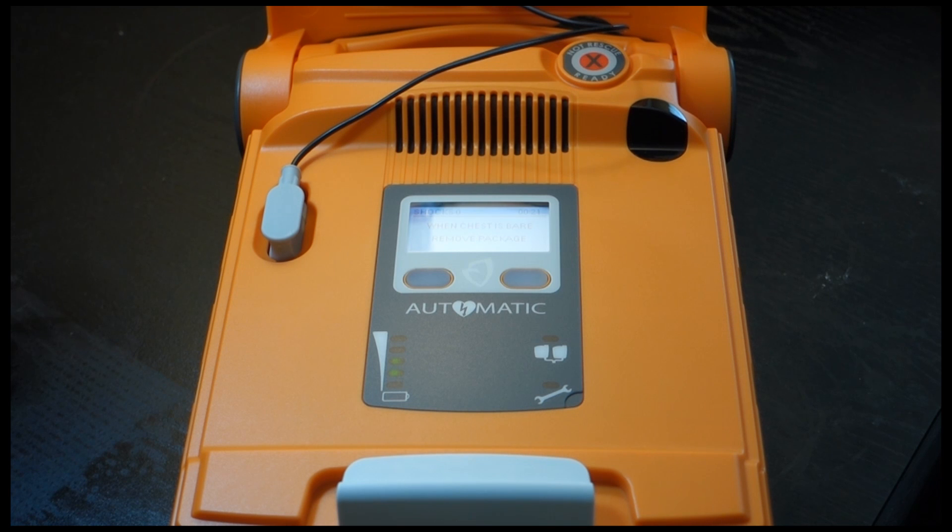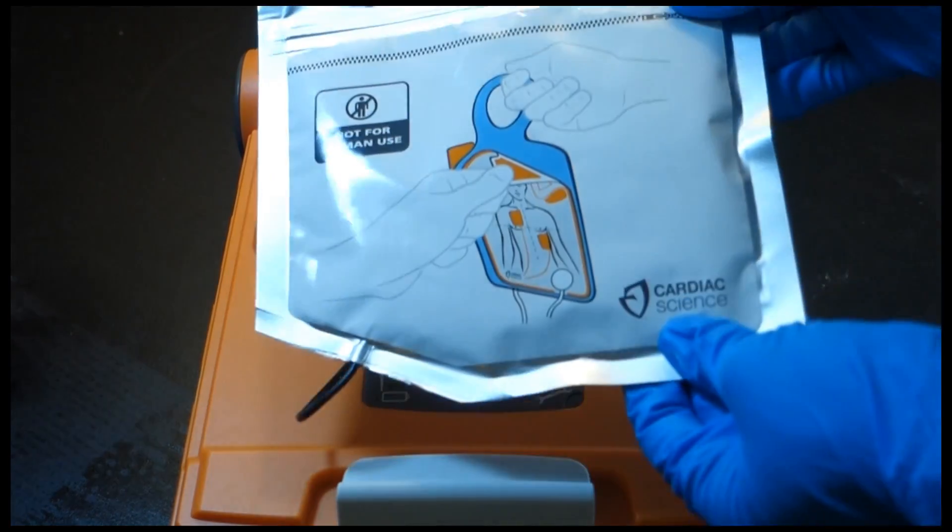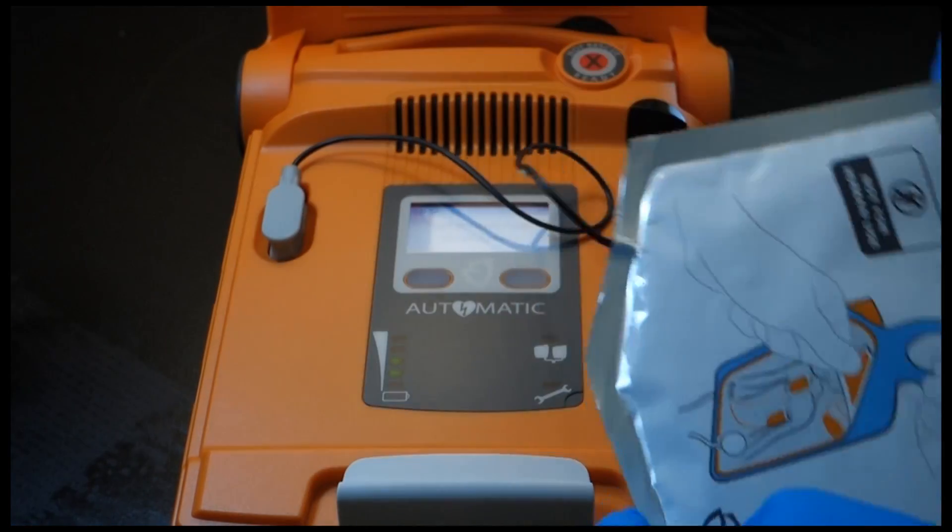When the patient's chest is bare, remove the white square package from the lid of the AED. Tear open the white package across the dotted line and remove the pads.